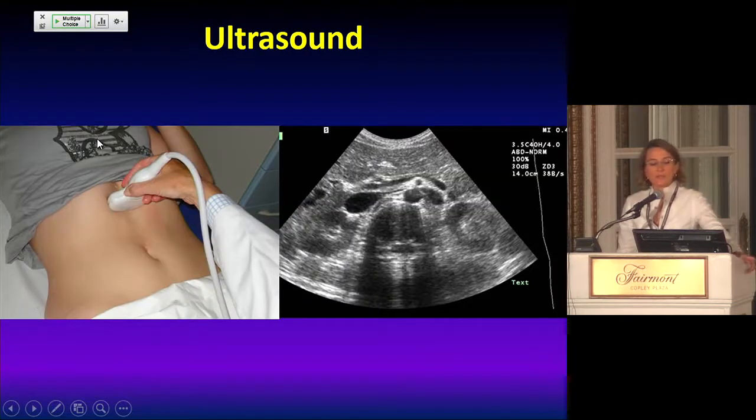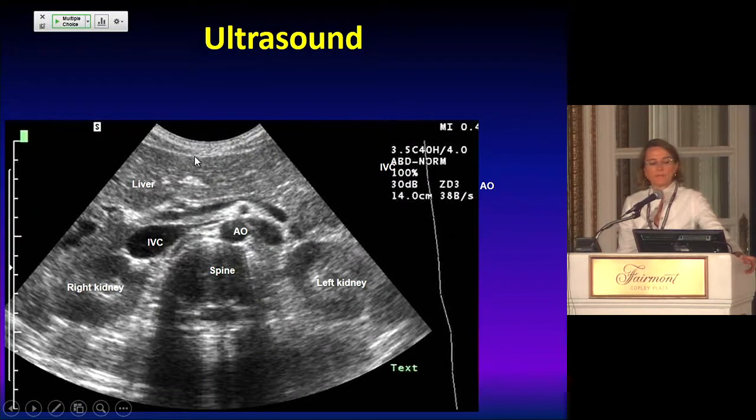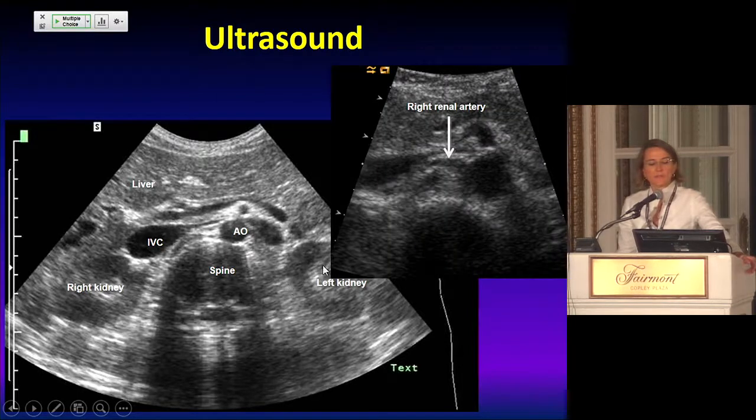And similarly on the ultrasound, you look very high up in the epigastrium within a transverse cut and obtain this image where you have the liver first, the spine here with extinction, the aorta and the IVC. This is the SMA. And then the right kidney would be here, the left kidney would be here. And you do need to look hard for a structure that is 5 to 6 millimeters wide and have good machines to do that, especially if the patient is very heavy. But about 10 o'clock or at 4 o'clock, you would have the offspring of the right and the left renal artery.